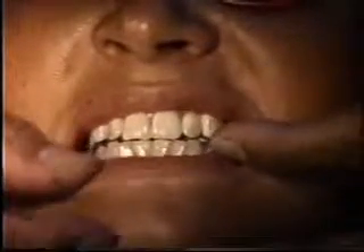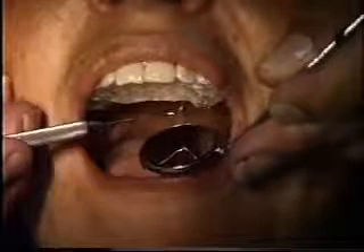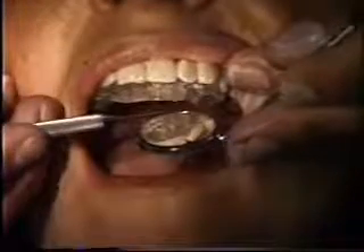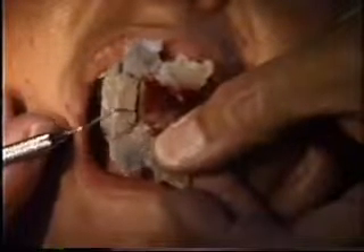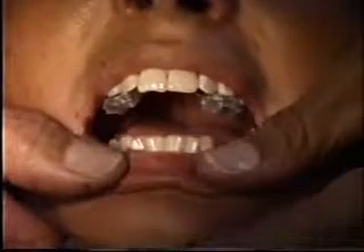So at this point now, we'll cut out the incline. We'll cut out the area behind the incisor teeth so that it will free the tongue space. This will be done where the line has been drawn — just mesial to the cuspids, then going back to the lingual area, coming up across, and then the mesial of the upper left cuspid. Now we have the anterior guidance plane separated from the main portion of the appliance. This will free up the tongue, and when we put it in, we'll see a difference in her speech, although I have to take off a few of the rough edges.